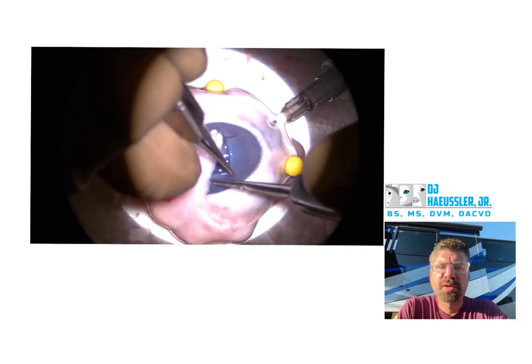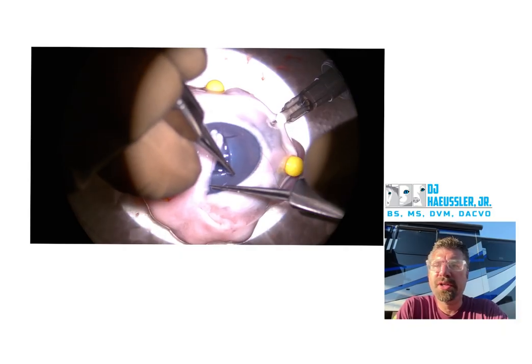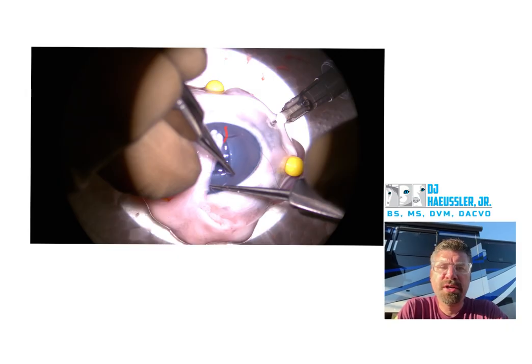Right here — your initial suture placement should go right here, right at the corner. Yours is off a little bit right there, so you want to put that right in here. And then you can also see that this extra cut there is kind of glaring at us.